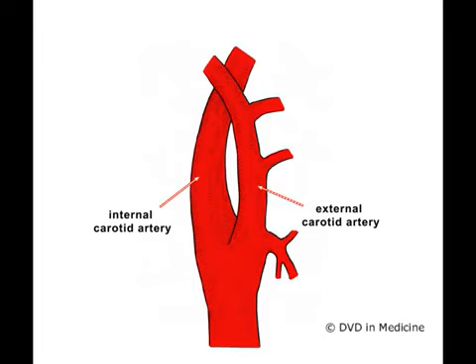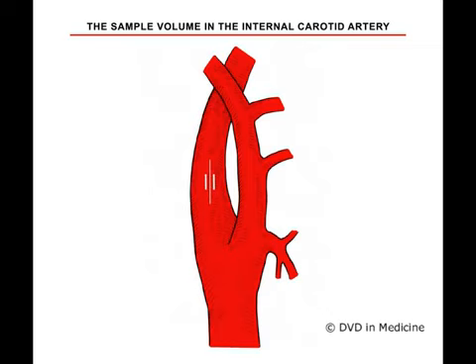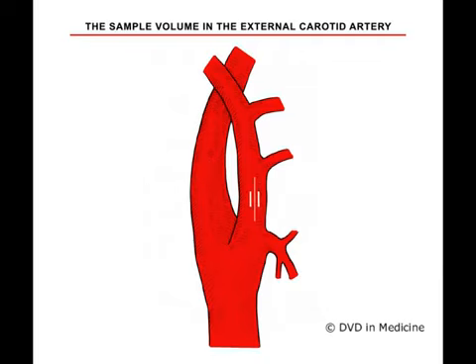The internal and external carotid arteries also have different audio signals. The audio signal from the internal carotid artery is softer and more wispy compared to the signal from the external carotid artery.